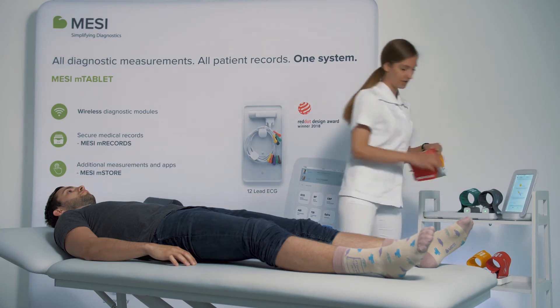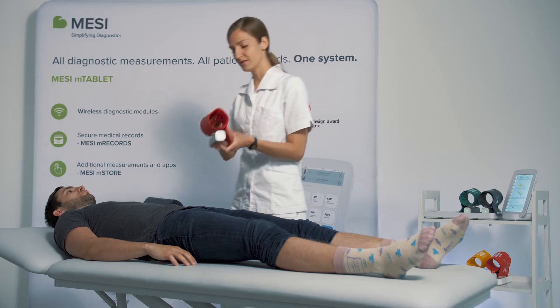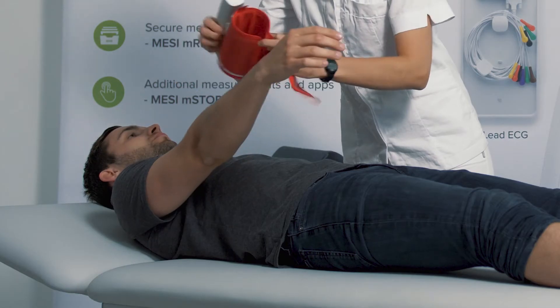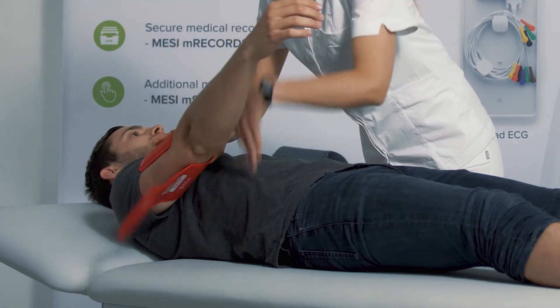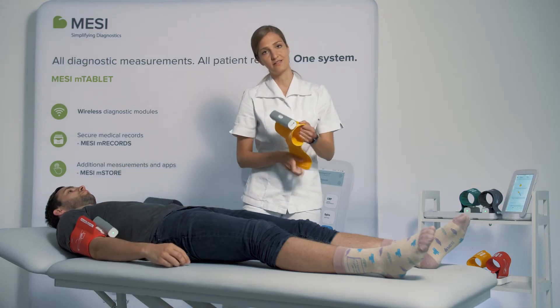We will start with the arm cuffs. Please make sure the arrow is turned to the inner side of your arm and that they are fastened sufficiently.